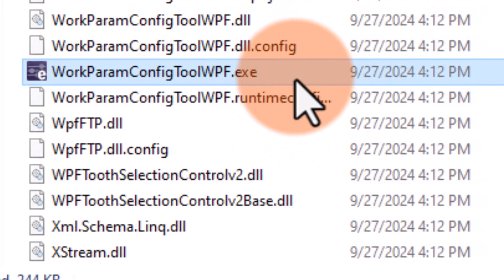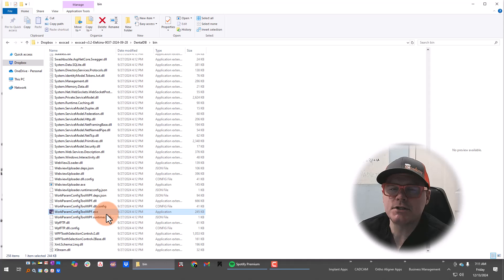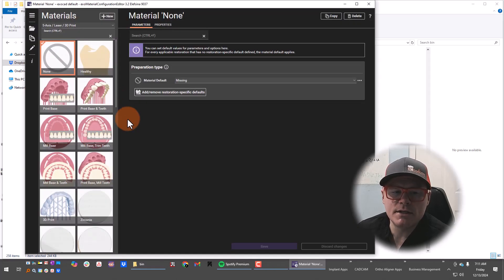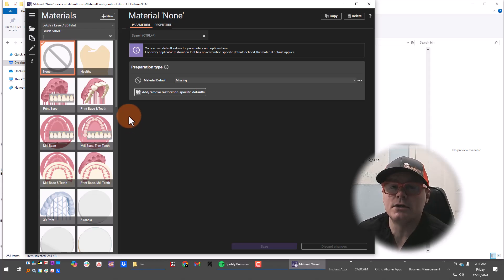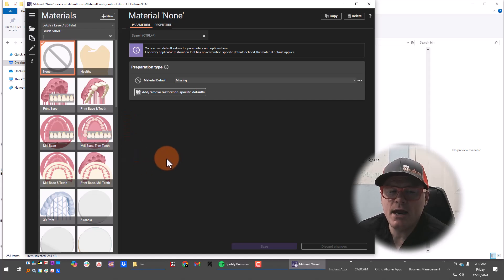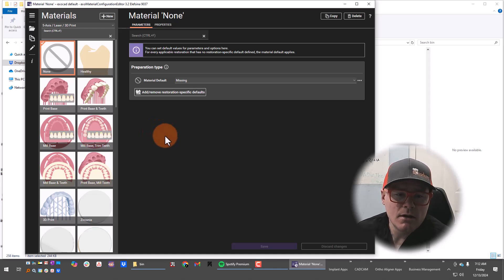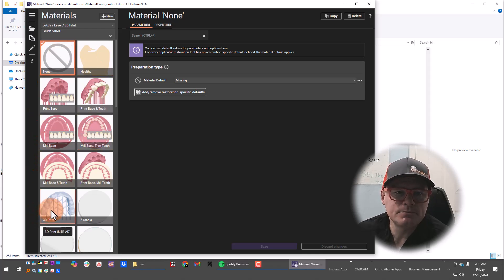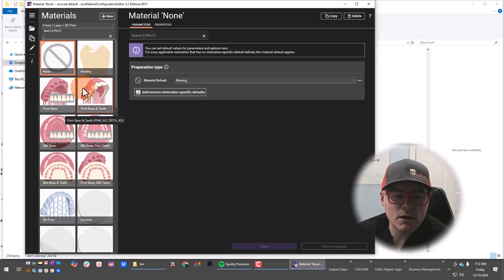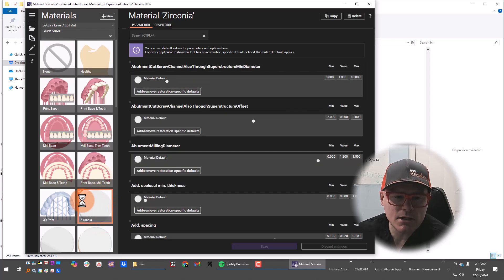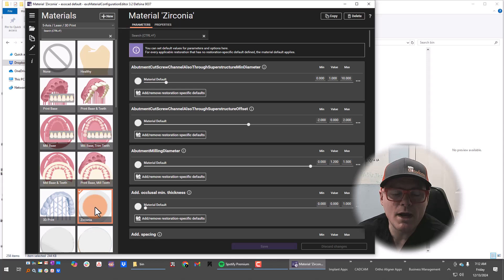We're going to start that program. If you have multiple versions of ExoCad, this tool is in every version and it saves settings for that specific folder. So if you're using multiple versions, you're going to have to run this tool every single time you install a new version. This is the work parameters configuration tool, and on the left side you'll see all of the material choices. For crowns, I use the zirconia material option, so I'm going to click Zirconia in the right column.